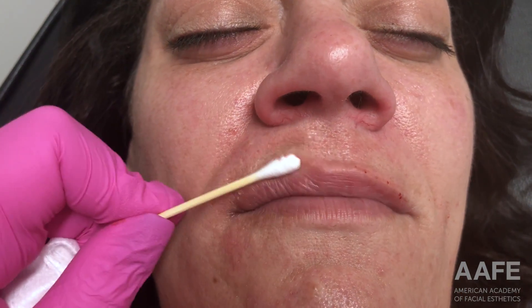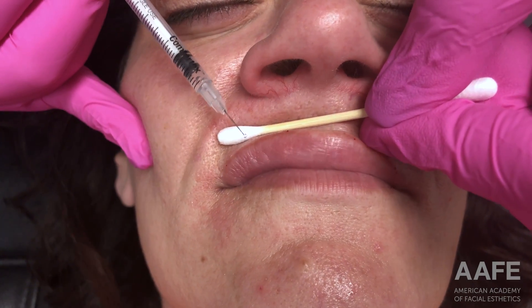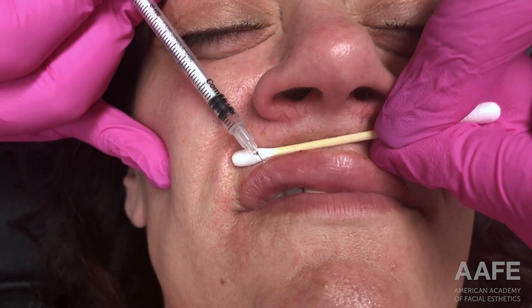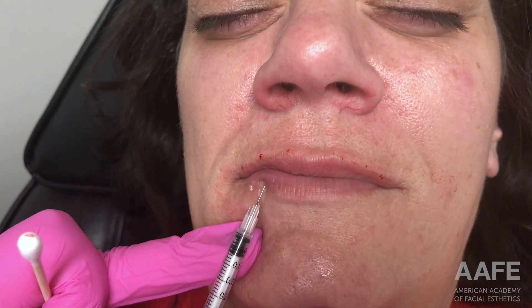That technique tends to be very spicy for patients. Even though she was topically numbed she can still feel it a little bit. But what's nice is that all of the products we're using for lip filler have lidocaine in them, so as I'm injecting across the entire lip I'm actually making her more numb and more comfortable. This technique tends to be pretty pinchy, but once we get filler everywhere in the lips the patient gets more comfortable and tolerates the procedure more and more as we go on.